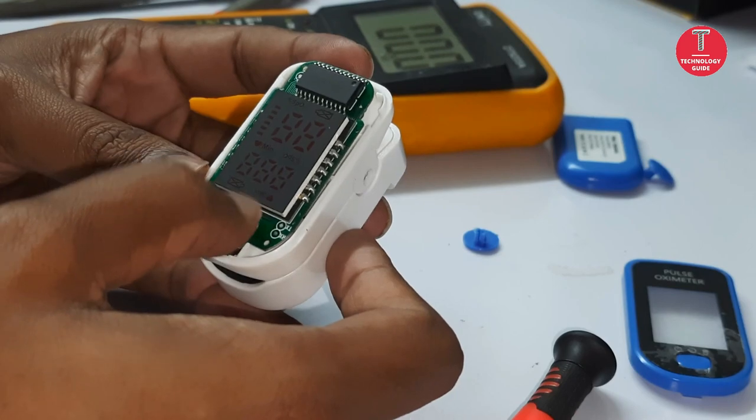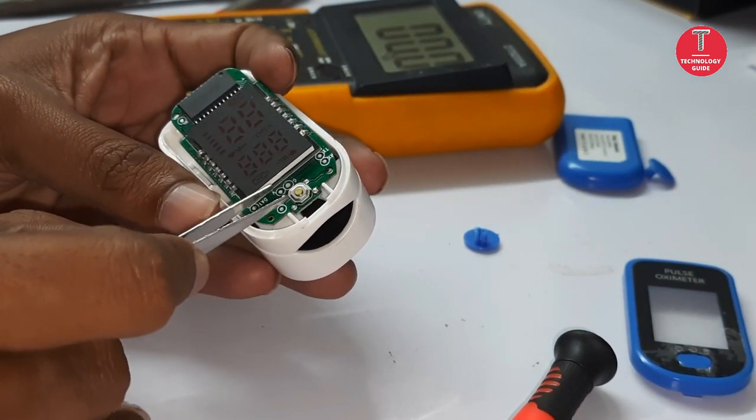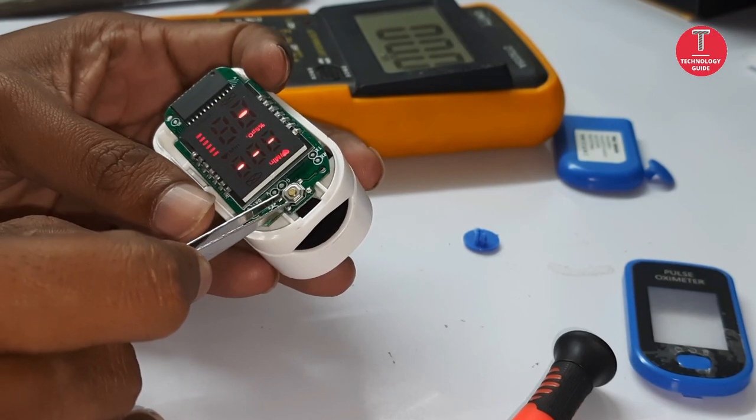Finally, switch damage. Now we need to change assembly push button switch.